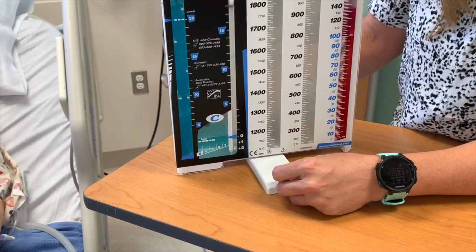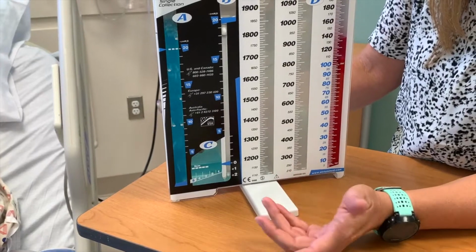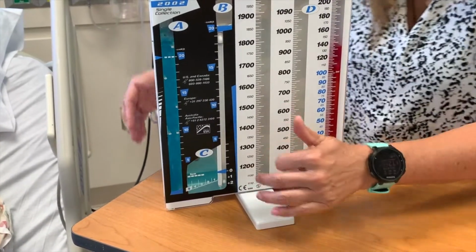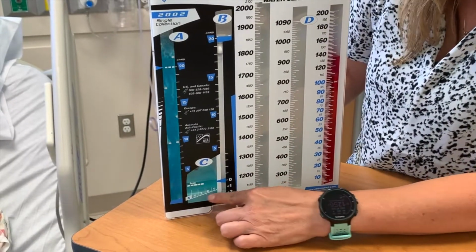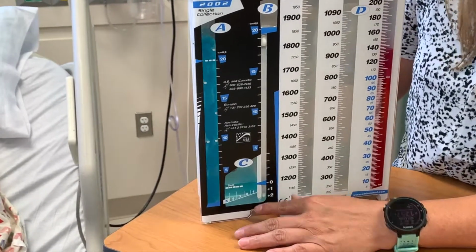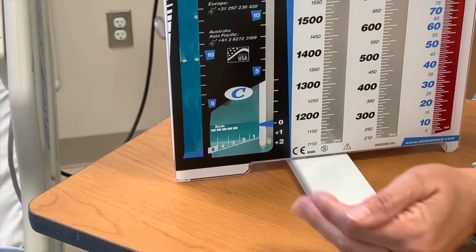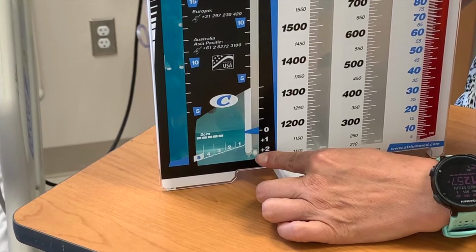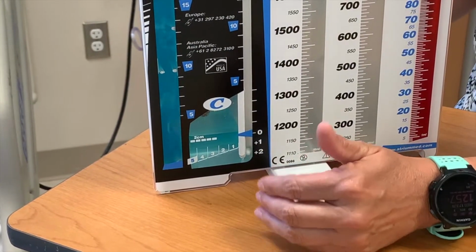That's going to happen because the patient's breathing in and out, and just changing the pressures that are in the lung cavity. Now, if your patient has a newly inserted chest tube, we know there's going to be air in it, so there's going to be a noted bubbling over here, and this is going to be an air leak bubble, all right? The degree of bubble, there's these magic numbers 1, 2, 3, 4, and 5. The more air leak you have, this little ball here will go over to the different chamber and tell you the degree of air leak.